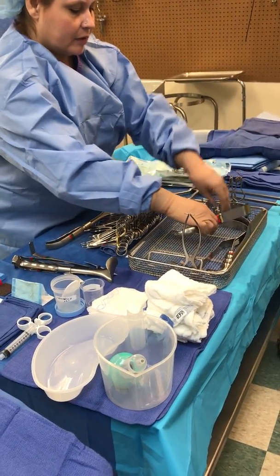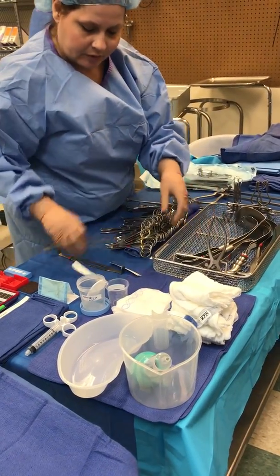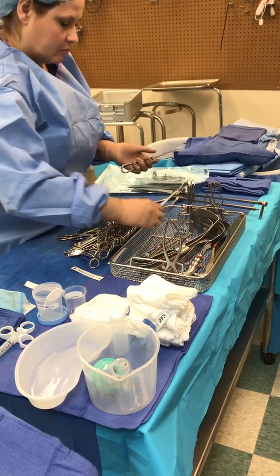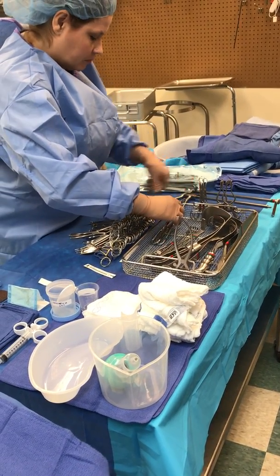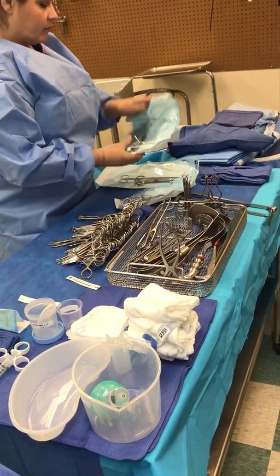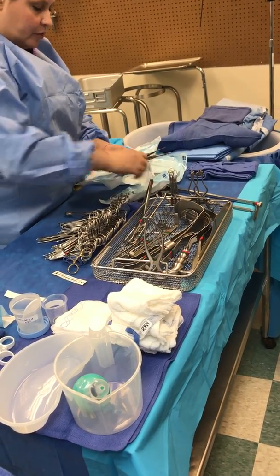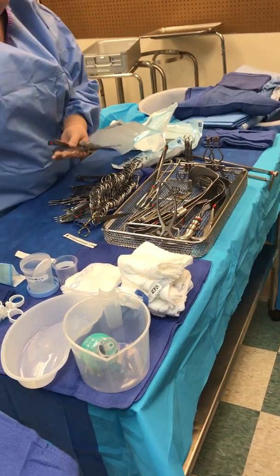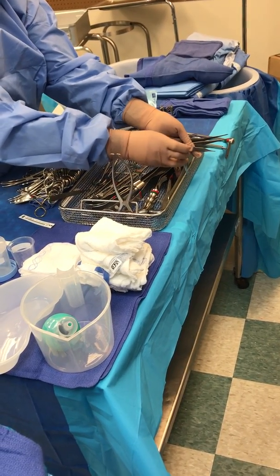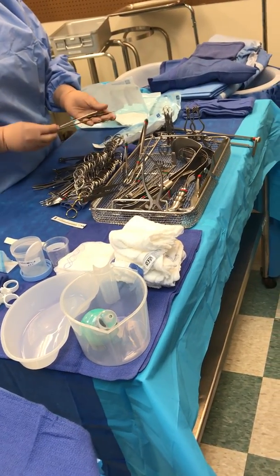Instruments, just the same. A big rich for such a small tray. I'll put these here. You see, I don't have to think of where I'm gonna put this because all I have to look for is the teeth. Because I always put them the same. These are dressing forceps, I put them back here, because you don't hardly ever use dressing forceps. Ever.